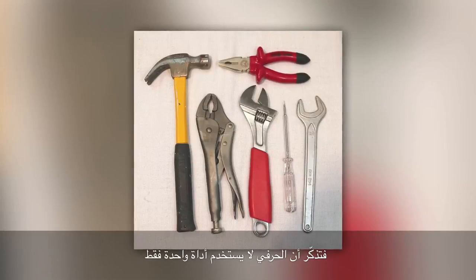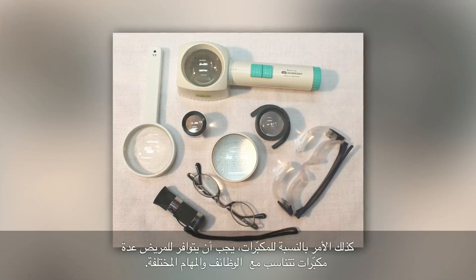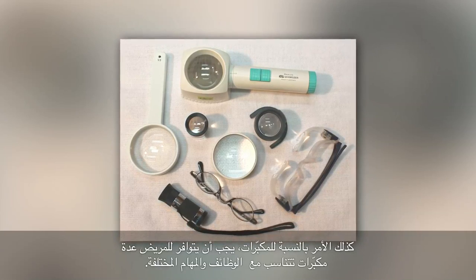If we think about magnifiers as tools, a craftsman wouldn't simply use one tool, they have a box of tools using the appropriate tool for the job. This is exactly the same with magnifiers, where patients should have a range of different magnifiers which are appropriate for a range of different jobs or tasks.